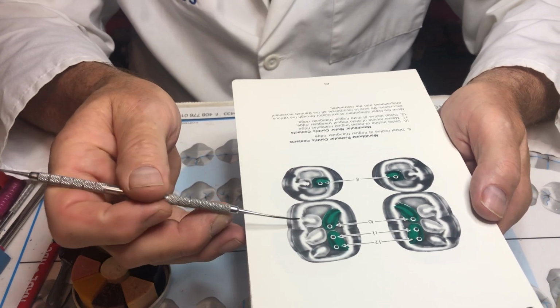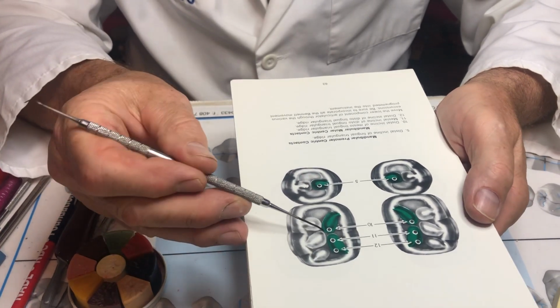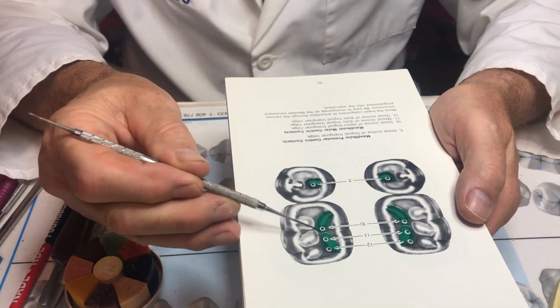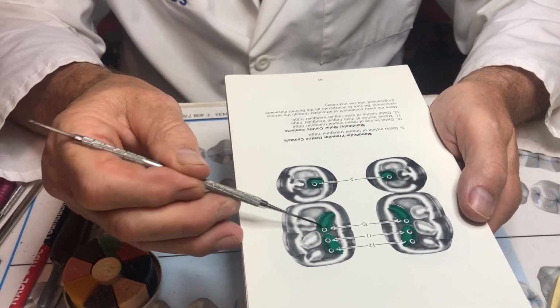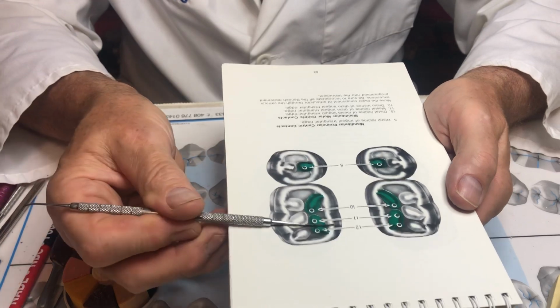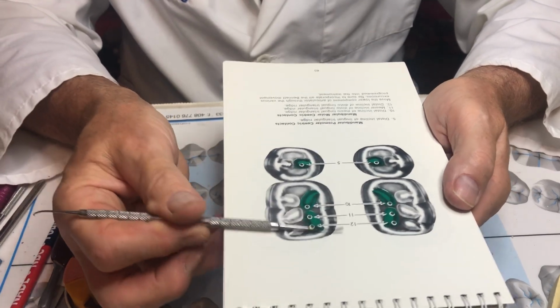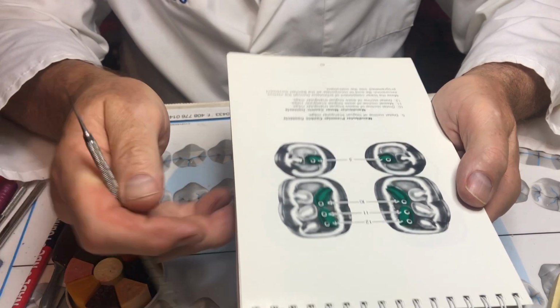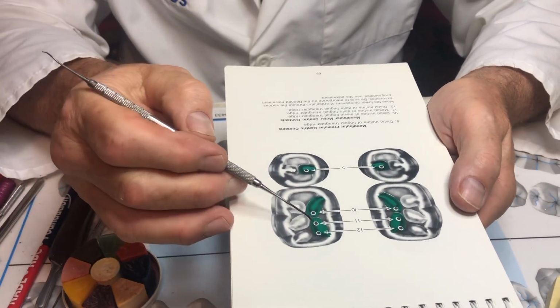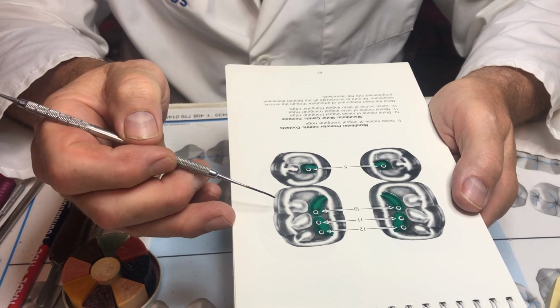These are not transverse ridges, they're triangular ridges, and the contact, remember, mesiolingual cusp of the upper first molar occludes with the central fossa of the lower first molar. So if you wind up just doing them straight all the way across, you're never going to have the correct contact. So okay, now that we know this, and again, you should look at the book, you should think about it, figure out what you're going to do before you even start.